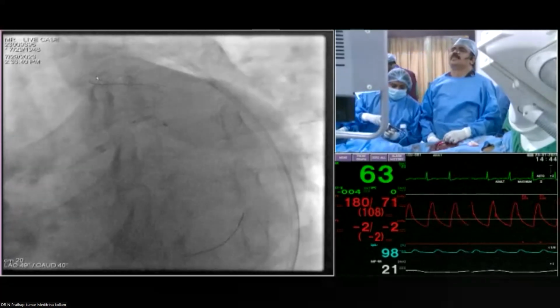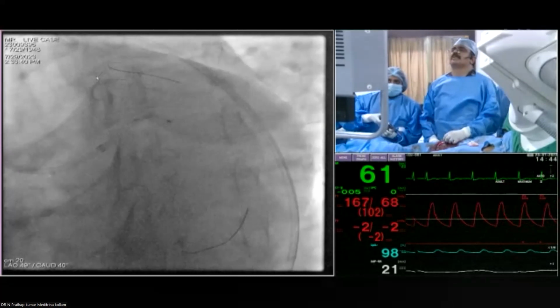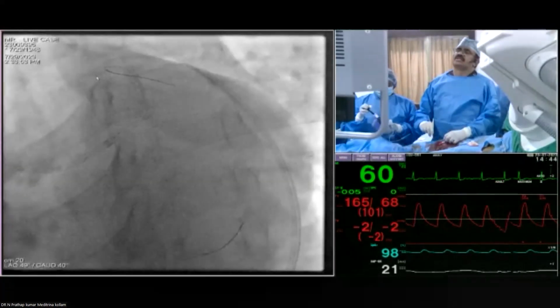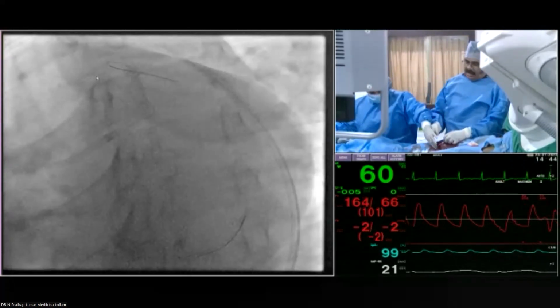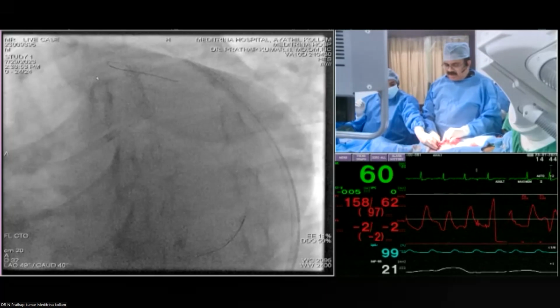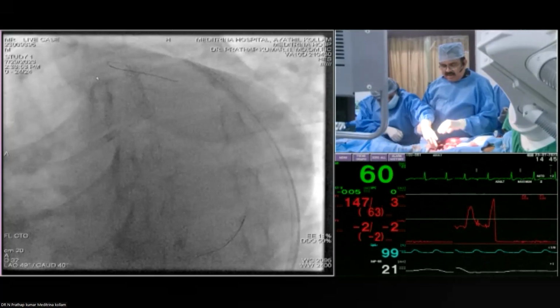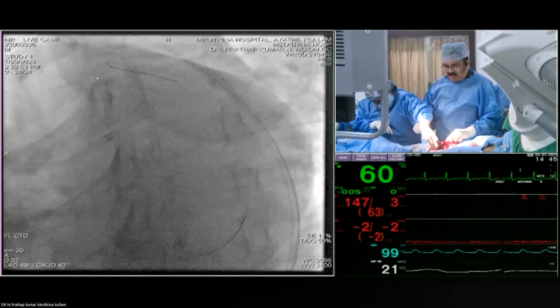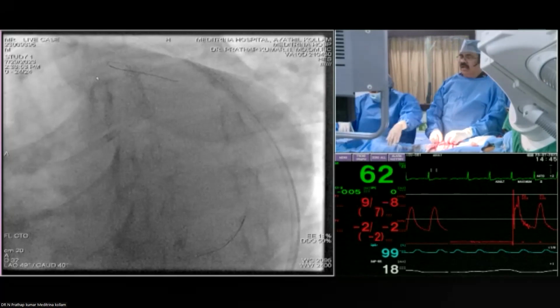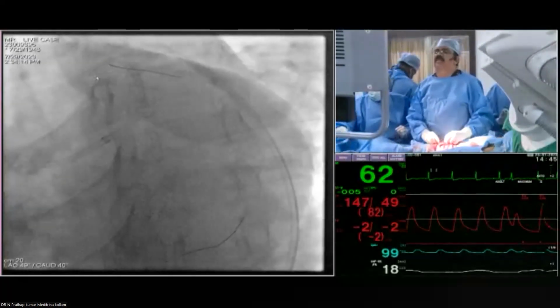Yeah, I could imagine this. If you see in imaging, a lot of calcium, deflate, a lot of calcific lesions. Moreover, the patient had a stent inside the LAD. So whether the calcium is inside the stent or outside the stent, I don't know. Probably there is calcium inside the stent also, so we have to do something there. But I was thinking that the stent is probably protruding into the circumflex. Yeah, but it is not.